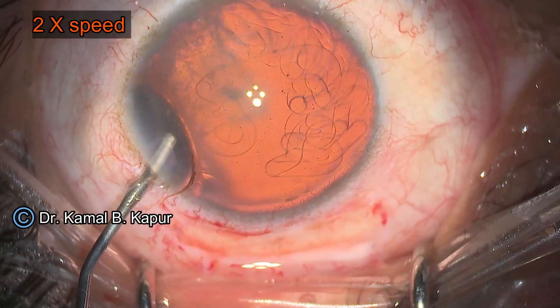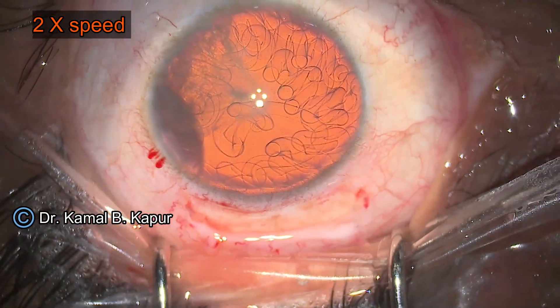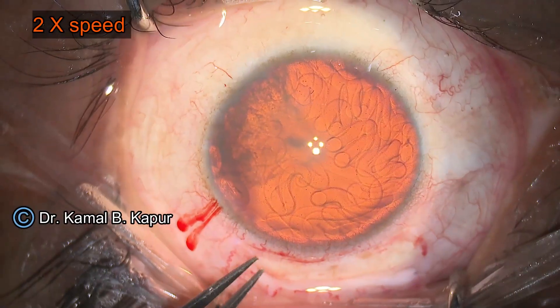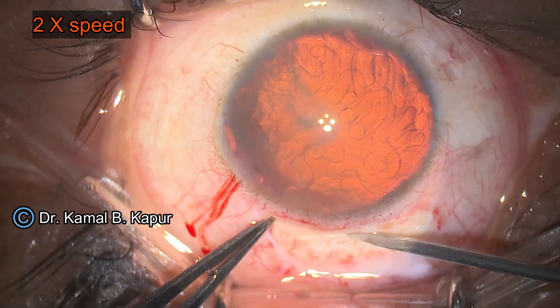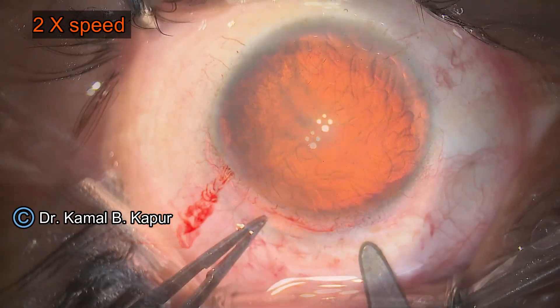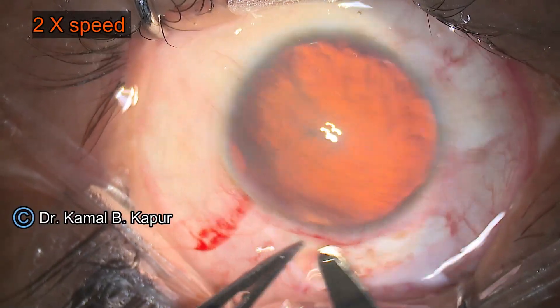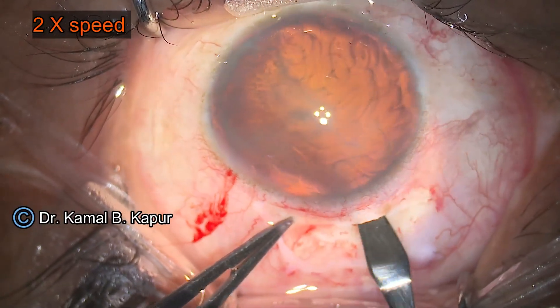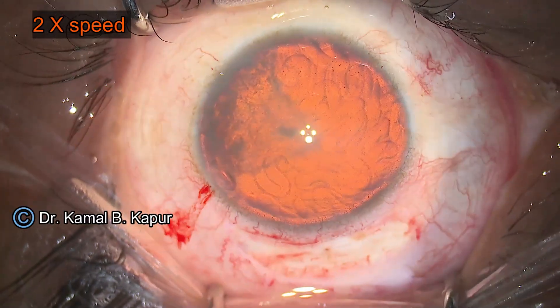The reason being, unlike a foldable lens, these are PMMA lenses and they cannot be folded. Any amount of pressure on the haptic can end up breaking it, because these haptics are also made of PMMA and are very brittle. We create a scleral tunnel with an intrascleral tunnel length of approximately 1 to 1.25 millimeters.